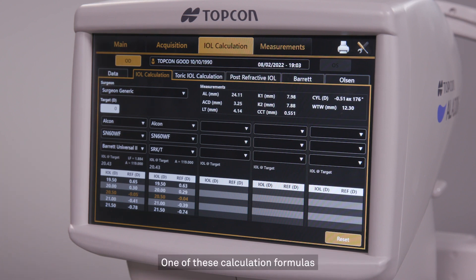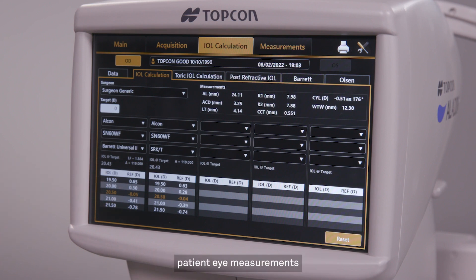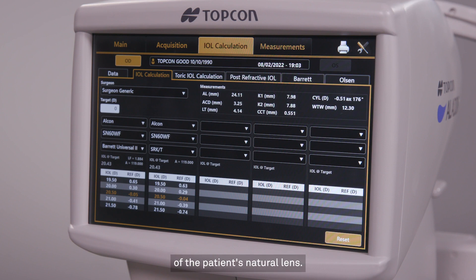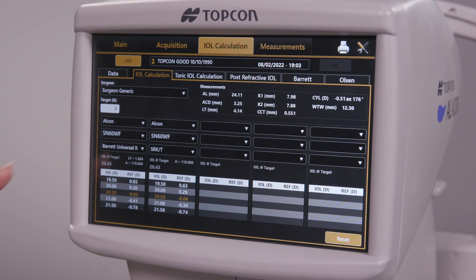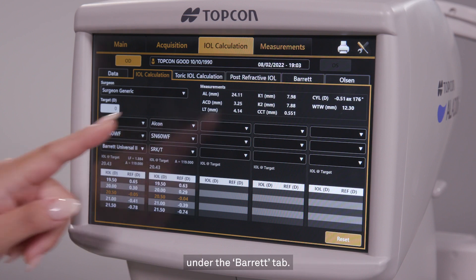One of these calculation formulas is the Barrett Universal II, which was designed to take into account patient eye measurements beyond the standard axial length and keratometry, including anterior chamber depth and the thickness of the patient's natural lens. The Barrett Universal II is also one of the options you will find under the Barrett tab.